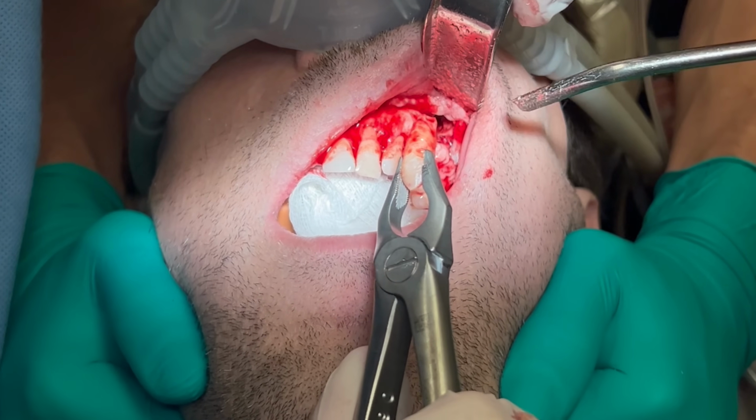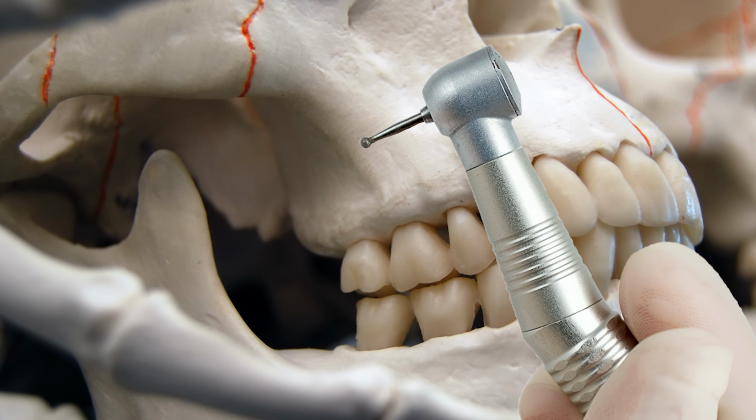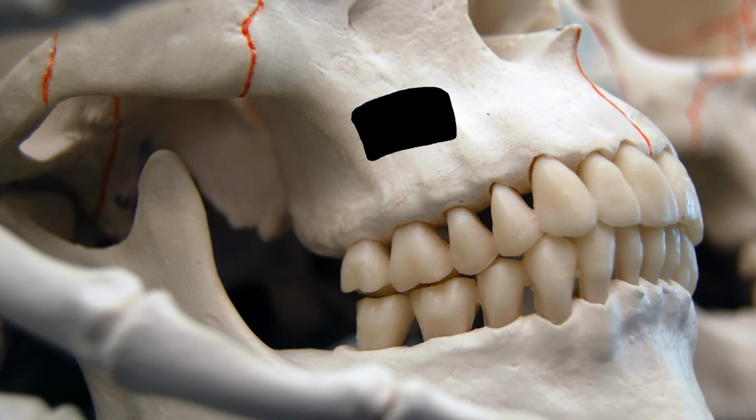Unfortunately, the tip of the maxillary canine is free floating in the sinus. I don't want to lose this root tip into the sinus cavity because it changes the size and scope of this procedure substantially. I would need to perform a Caldwell-Luc sinus surgery and explore to retrieve the root.